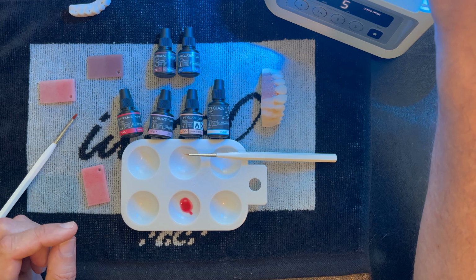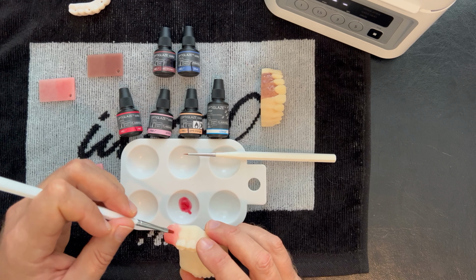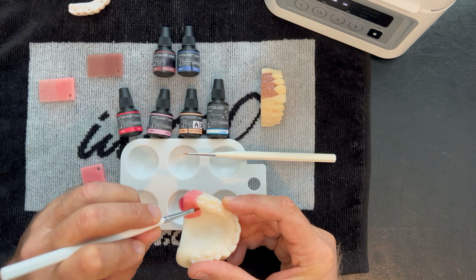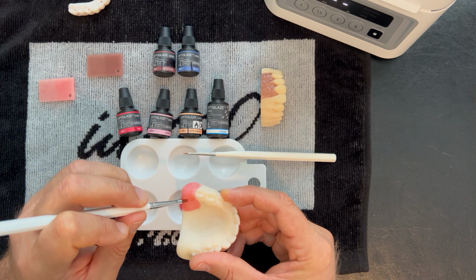And what that does is allows me to pick up more color saturation, because now this layer is sticky. You see how that's sticking to it. And if you think you've put too much on there, just keep brushing it. You can spread that out, as you can see as I'm doing here. Around the neck of the teeth, I will typically not do a second coat. That allows me to get a little bit of lighter shade gradient.